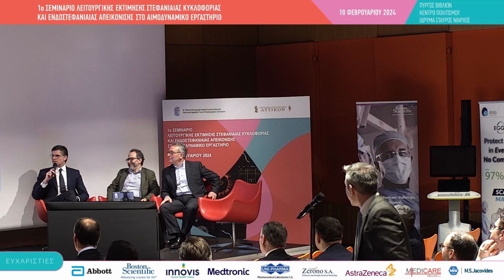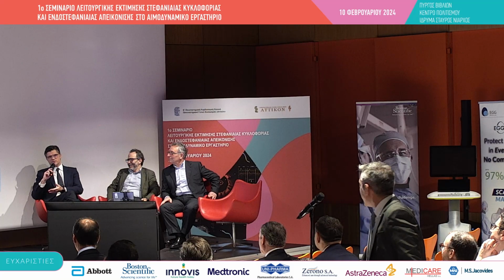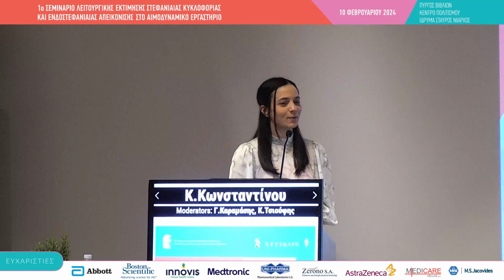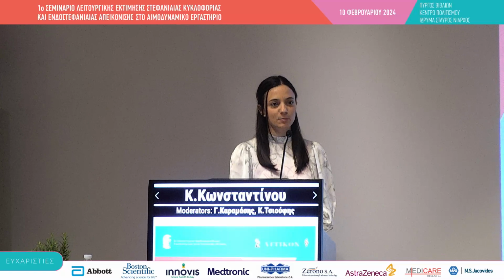So I think we should take advantage of Cleo, that's his experience on technique, and ask all the questions and see how we're going to do it here in Greece too. We don't use femoral access, so we go radial or distal radial. Generally, I don't give anything in the radial artery, even when I do PCI. I give sedation IV, intravenous diazepam, but I don't use a radial cocktail.